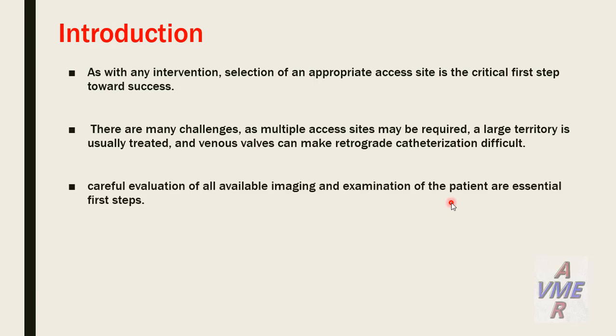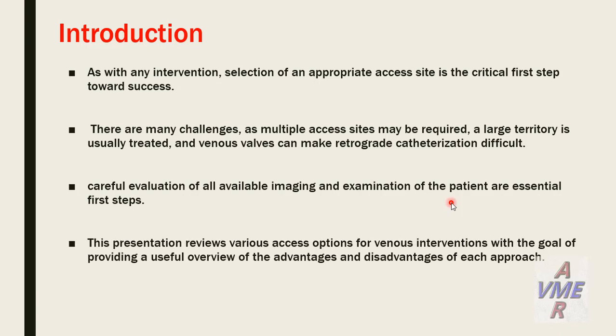Careful evaluation of all available imaging and examination of the patient are essential first steps. This presentation reviews various access options for venous intervention, with the goal of providing a useful overview of the advantages and disadvantages of each approach.